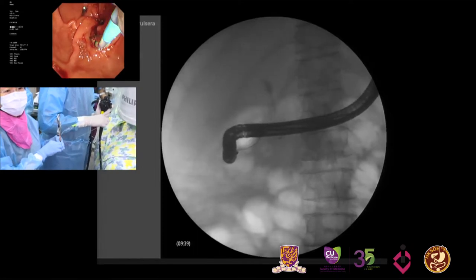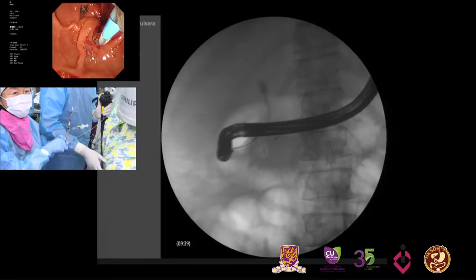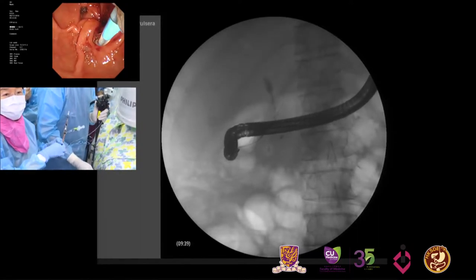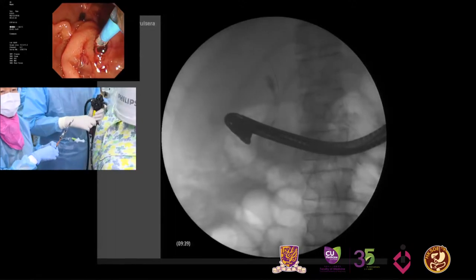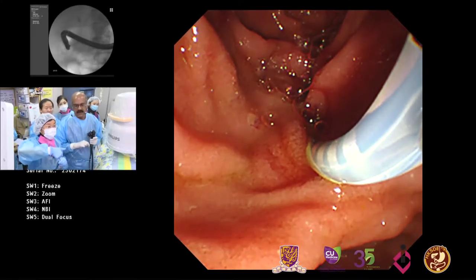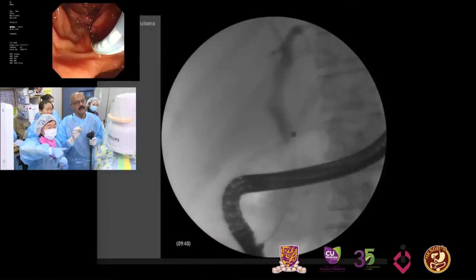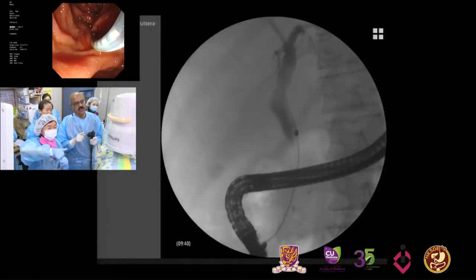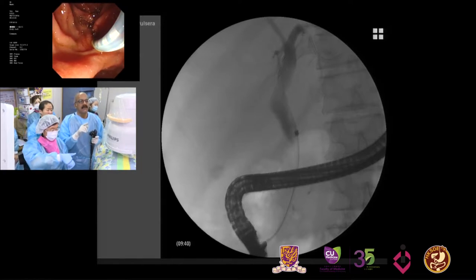If you can't, then we'll have to change to a J-tip wire. So I'm now pulling up so that we get a better view, and then I'm pushing back, and you can see how we have gone in now. Have you seen that? Esther, can you inject contrast? So we keep injecting. Now I'm going to define the lower end of the stricture. The lower end of the stricture is quite long compared to what we thought initially.